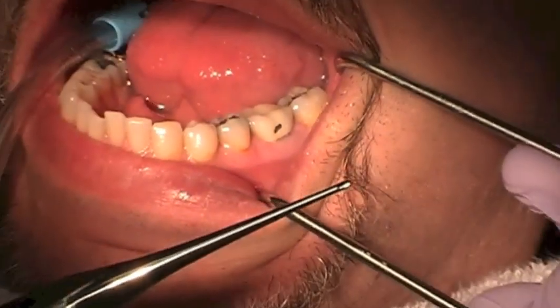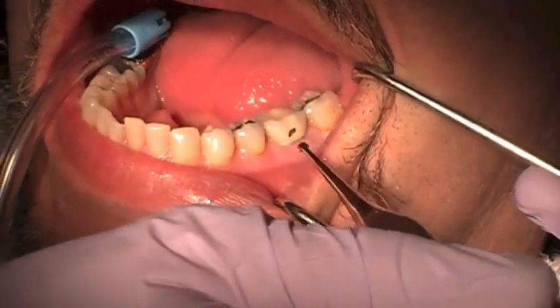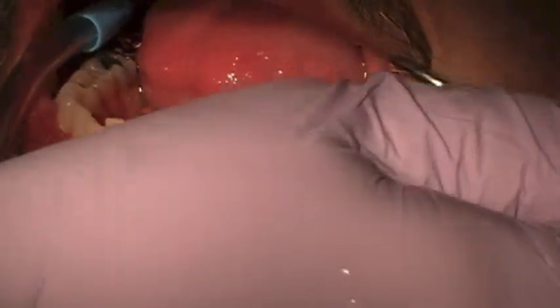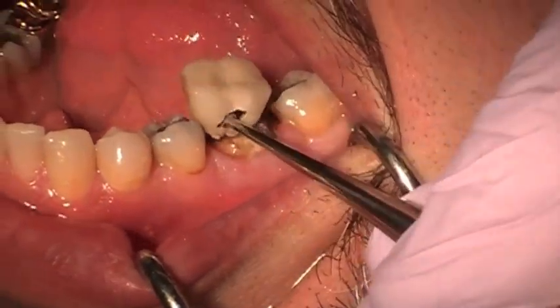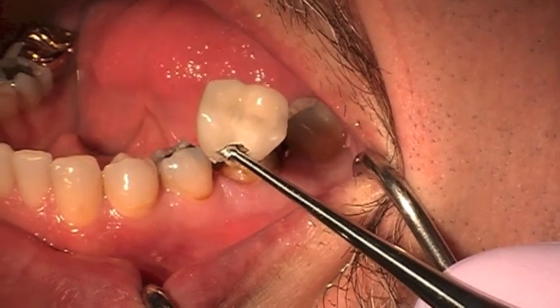I'm taking the Whamkey and placing it into the opening I made. I may have been a little shallow — I may have wanted to go a little bit deeper into the crown. But using some right and left rotational motion, the crown will actually pop off nicely, as we'll show here.